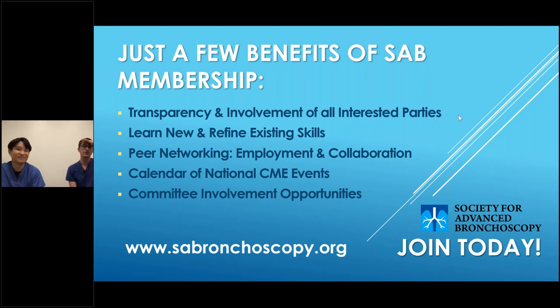That's a really good question. In terms of maintaining a training program, those numbers are set, and I believe they're currently set at 50: the required number of rigid cases for a fellow to graduate from an accredited IP fellowship is 50. Dr. Chang and I both went to programs that I think had a probably higher side of rigid volume. Whether we're right or wrong, I think we both lean in that direction of wanting our fellows to get a lot of rigid experience.